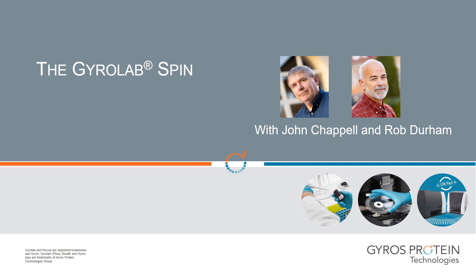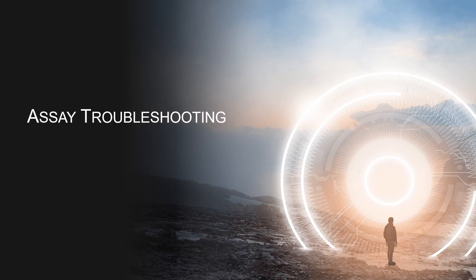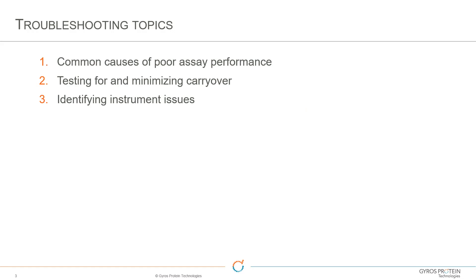Welcome to another episode of the GyroLab SPIN video podcast. My name is Rob Durham, and my name is John Chappell. Today's topic is assay troubleshooting. We're going to give GyroLab users some key tips and tricks for mitigating common problems you might see when doing assay development on the GyroLab system. The topics we want to cover are the common causes of poor assay performance, testing for and minimizing carryover, and identifying instrument issues.